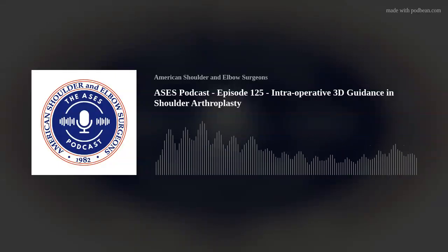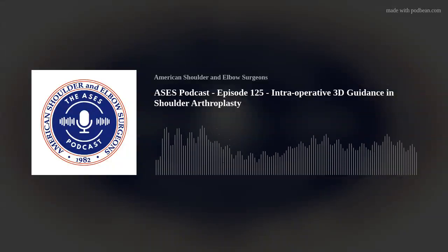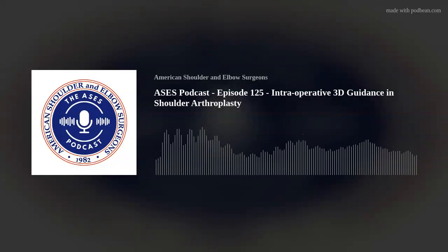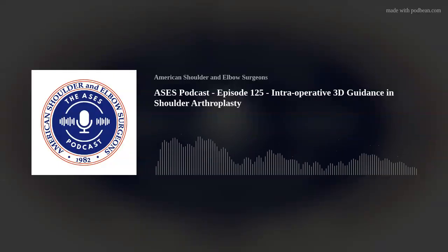And it's actually quite remarkably accurate, and that really gave me faith that, look, if you get the PSI guide to fit nicely in the navigation, they're almost identical. So that was a cool little experiment that gave me a lot of faith in both systems I use. That's great. I've always wondered that about, how accurate is PSI versus navigation.